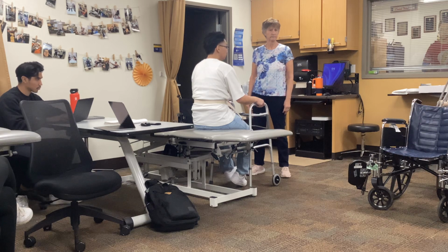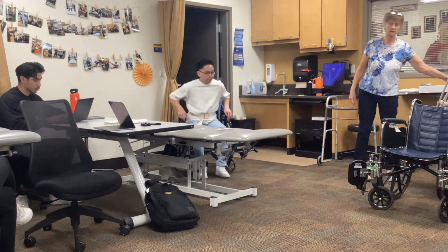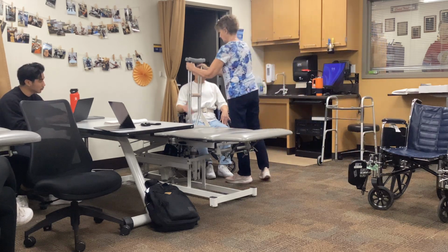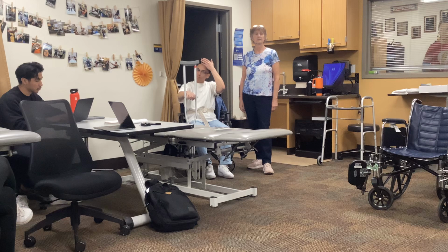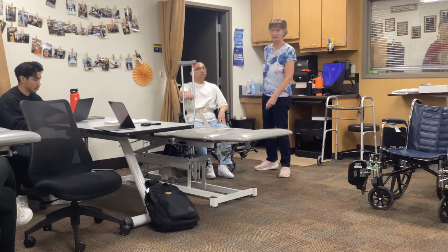Questions? Why don't you go back in the wheelchair? Okay, the same thing applies with the crutches. They go on which side when you stand up? The weaker side. Pardon me? I didn't hear what somebody said. The good side? His left side? The good side, is that what you said? Yeah. Louder. The good side.